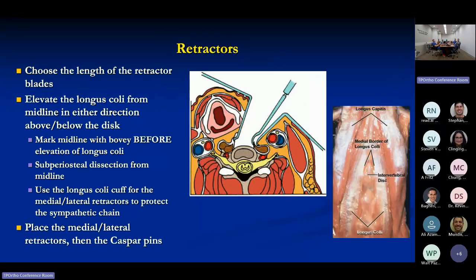A quick question. Yeah, go ahead. It makes sense about the intervening pin, you want it at the more caudal end of the disc or end plate when you hop it over. When you place the plate at the level caudal to the most cranial level, does that ever get in the way of the cranial aspect of that intervening pin? It does. But it's okay to take it out then, because you've used it to do your discectomy, your release, and your trialing. It's only with the plate application that it gets in the way, but by that point you don't need it. It served its purpose.